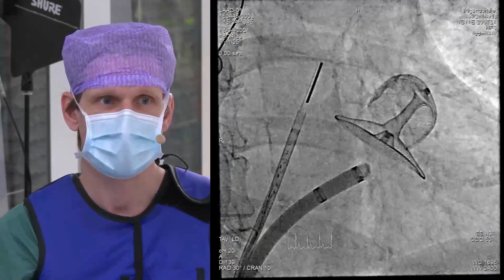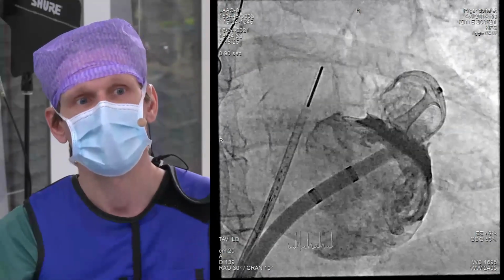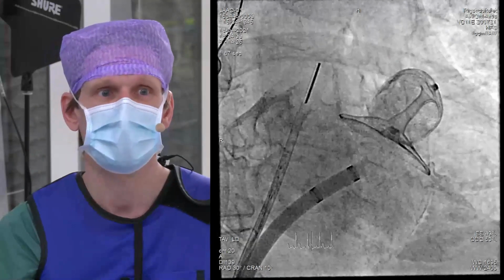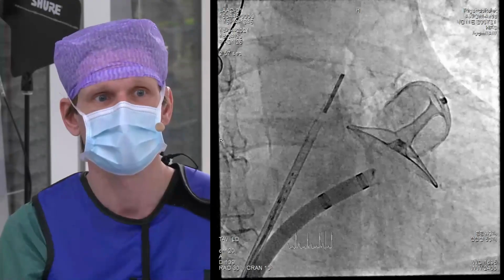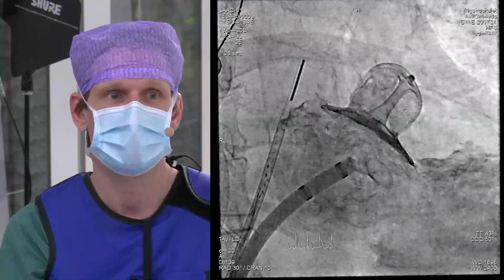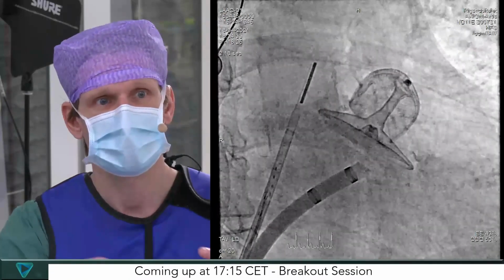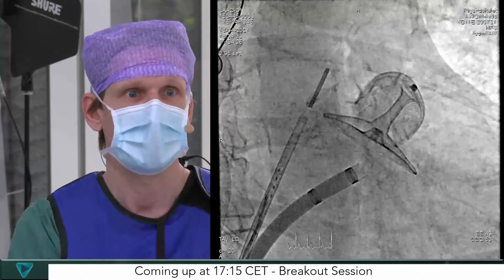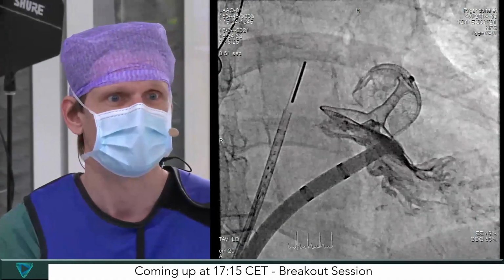As you could see in the initial shots, there were trabecularizations very high up, almost at the comedon ridge. So this would be almost impossible, maybe, to close with a single lobe device. So the fact that it has a disc and an anchoring part, and this extreme flexibility of cup versus disc in this particular Omega device, made it an excellent choice in this patient.